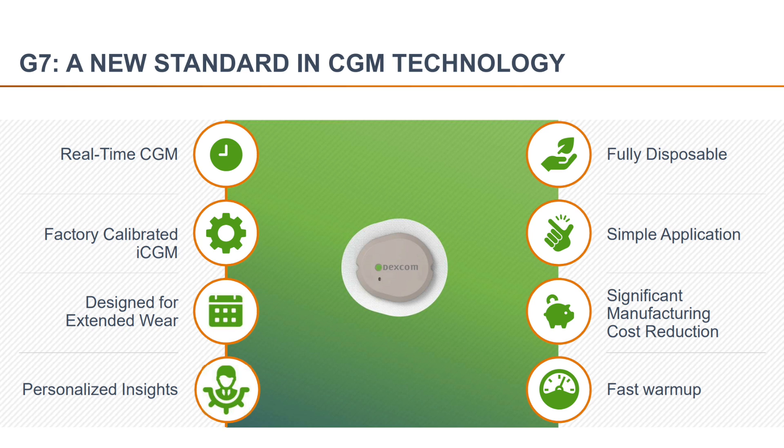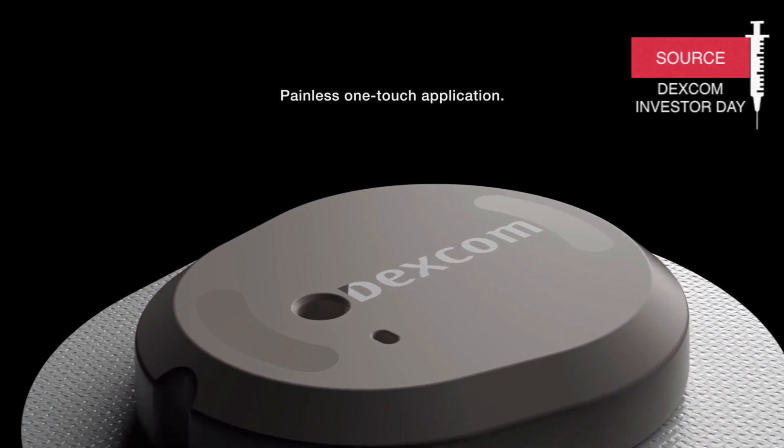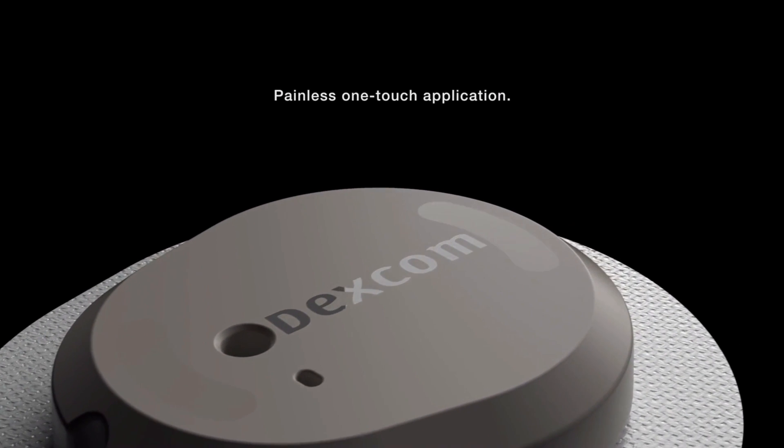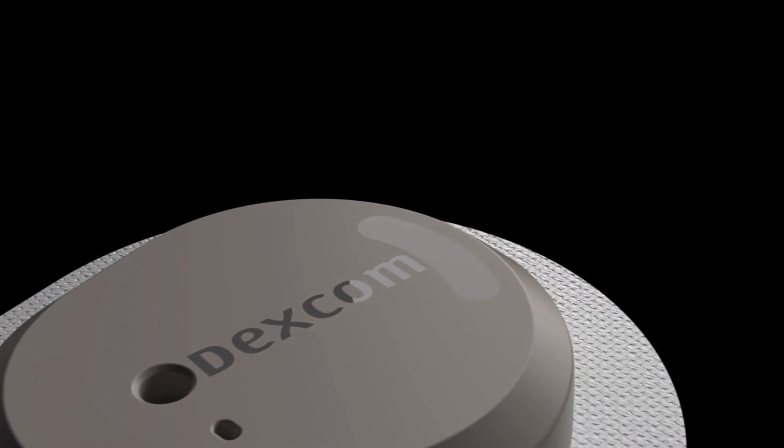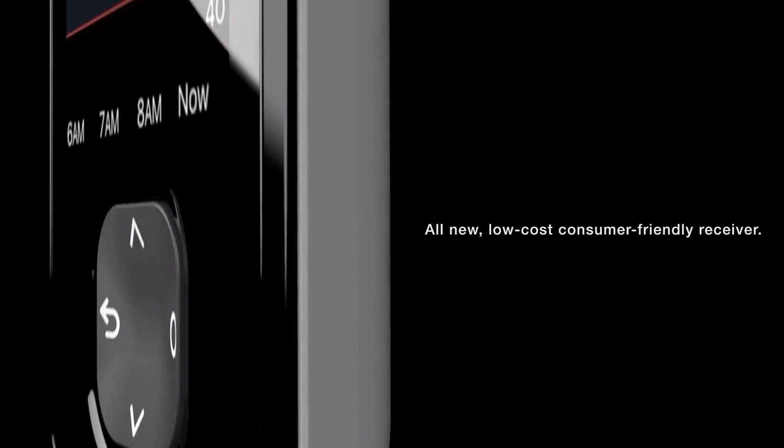So what is Dexcom G7? G7 is a real-time factory calibrated continuous glucose monitor. Similar to the Dexcom G6 and the Freestyle Libre 3, the Dexcom G7 sensor will not need calibration and will be able to securely transmit blood glucose data to your phone or other digitally connected devices via Bluetooth.